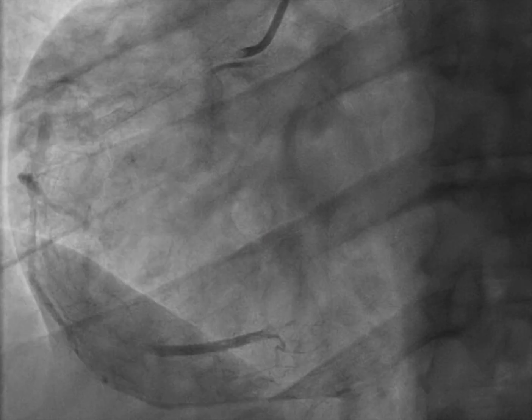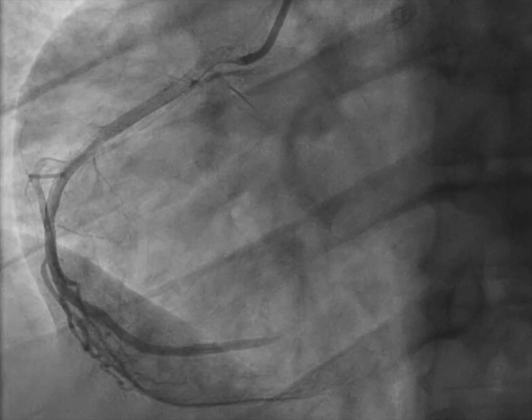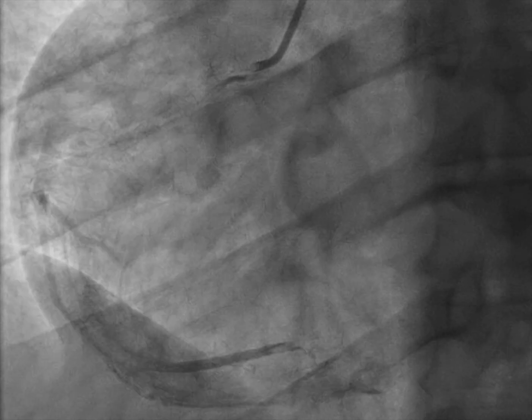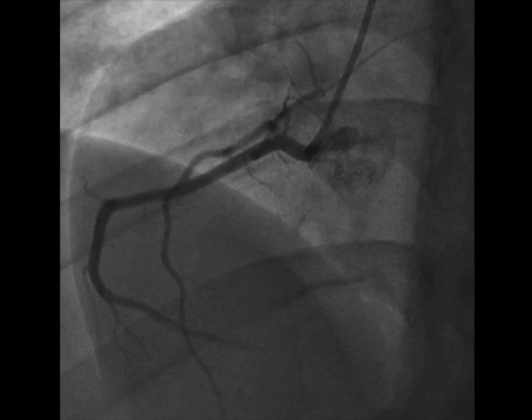So I'll allow this to play through once more at slow speed so you can try to take in the entire angiogram. And then I'll show you the old angiogram for comparison. So this is an angiogram from many years ago, and I'll let it play through a little bit and show you my annotations.